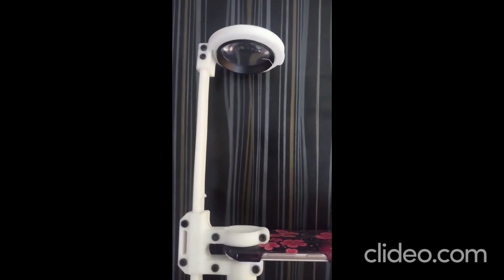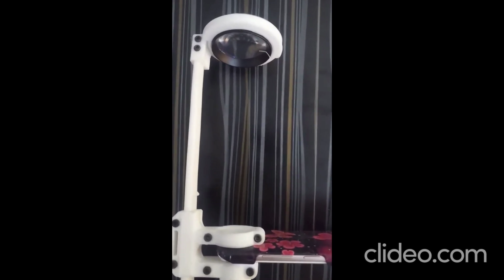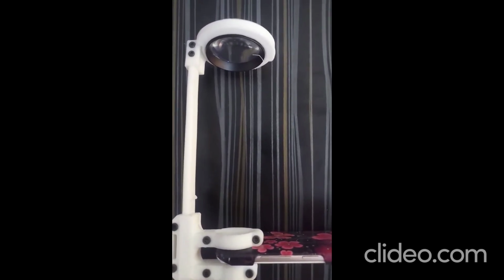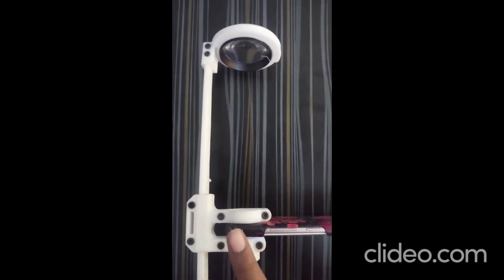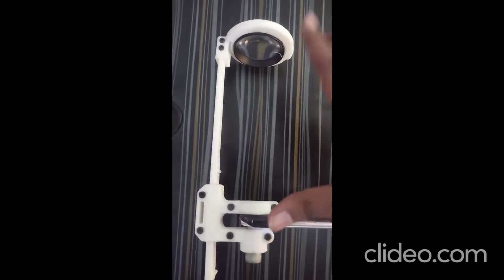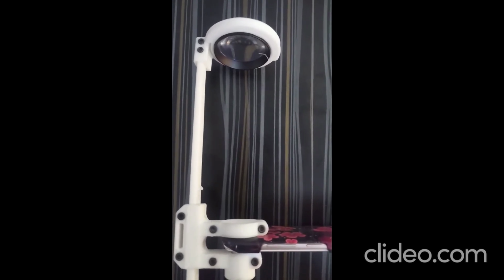We chose ODOX because with the Raspberry Pi we can only see the pupil size increased, but we cannot capture the area of interest where we can see both the optic disc and macula, and the same is the case with the indirect ophthalmoscope. In ODOX the distance between the phone camera and the lens is constant, so we can get a clear image with the optic disc and macula.